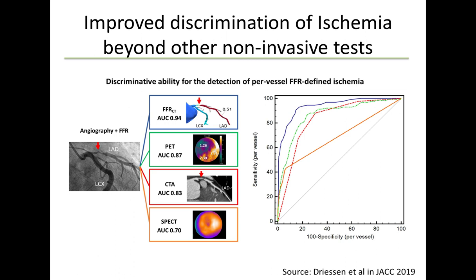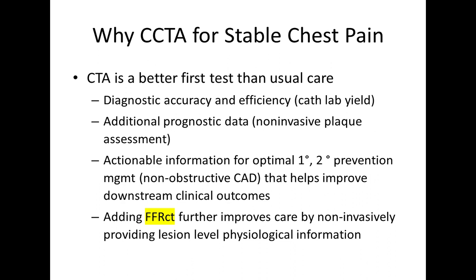So I'll close there, but I really do think that in the coming year we'll see broader adoption of CTA for stable chest pain in North America. We'll follow our European and our UK colleagues for all the reasons that I highlighted over the last 15 minutes.